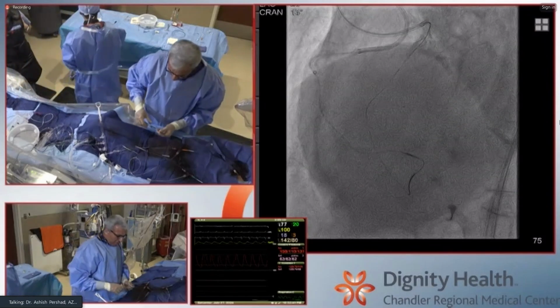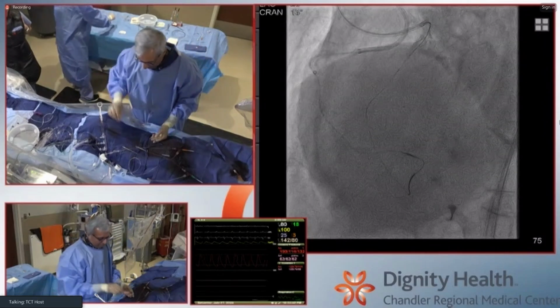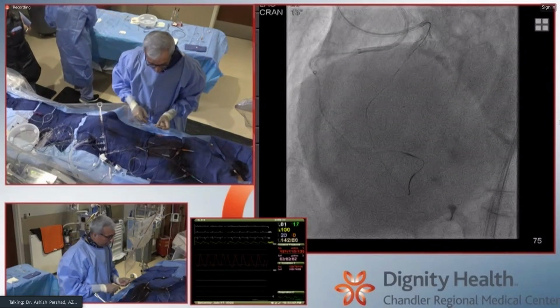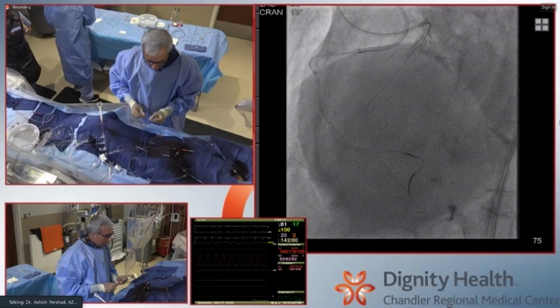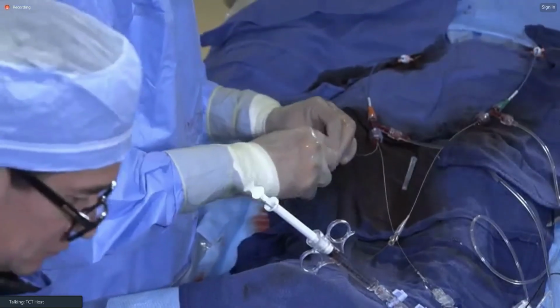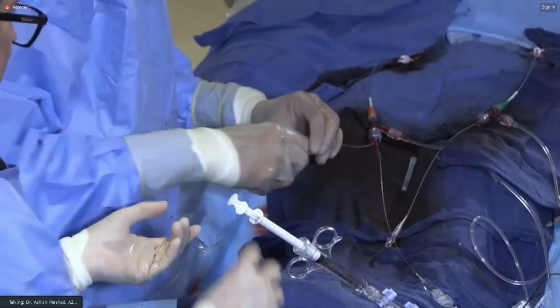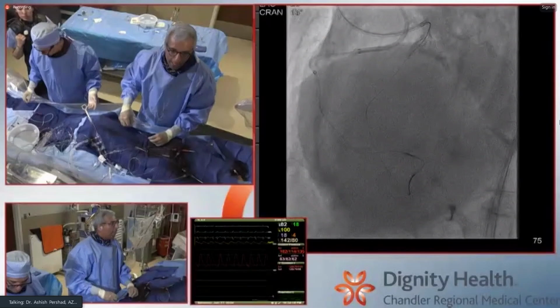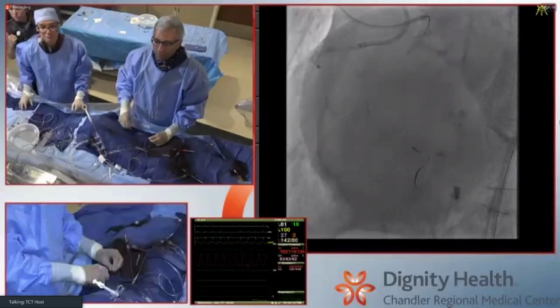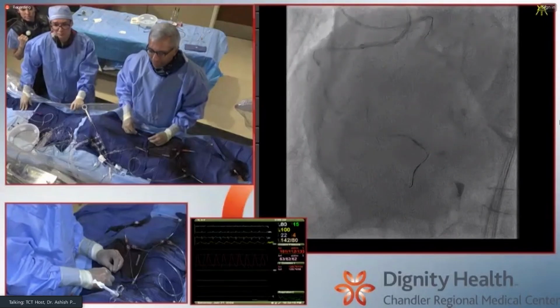No, not really. I'm getting brisk blood return. Not that it means anything, but it sure looks good. It's almost filling my microcatheter hub. I'm just going to get this down there, and then ultimately I think I'm going to need to image and rota, so we can. Well, we've got a Kiko sitting here on the panel as well, so we all want that image.